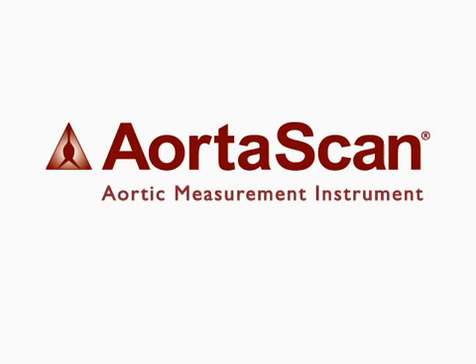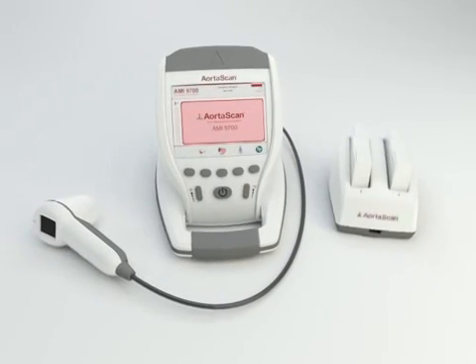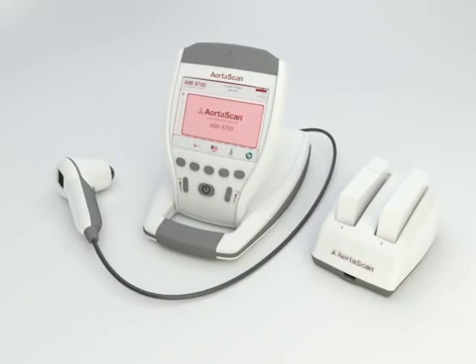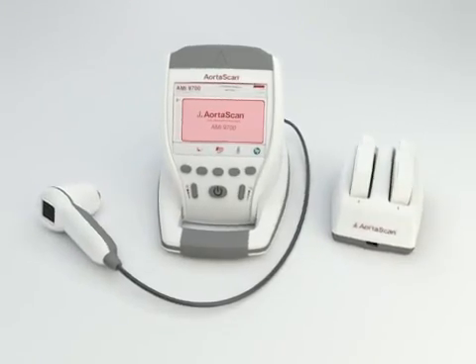Introducing the AortaScan AMI-9700 for the measurement of abdominal aortic diameter. Using non-invasive ultrasound, the AortaScan AMI-9700 measures the diameter of the abdominal aorta to help physicians identify the presence of abdominal aortic aneurysms.